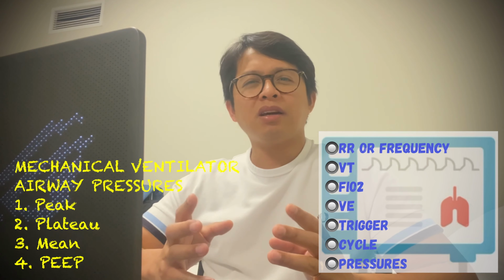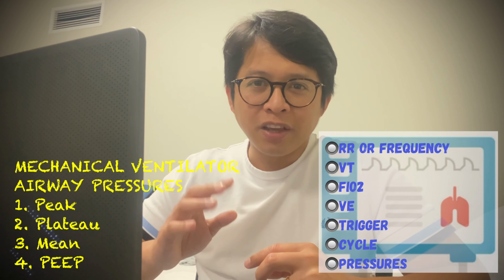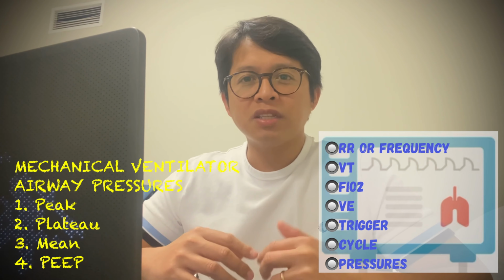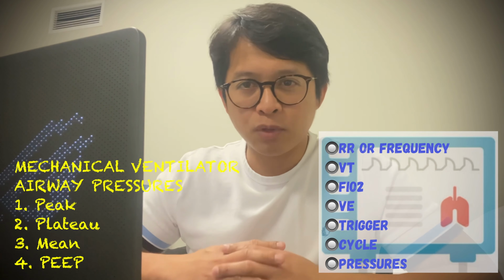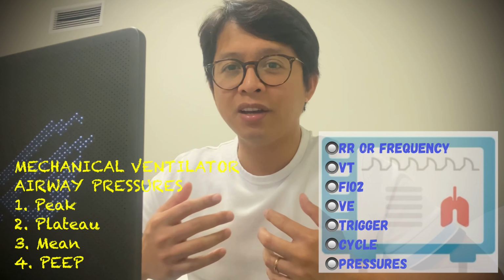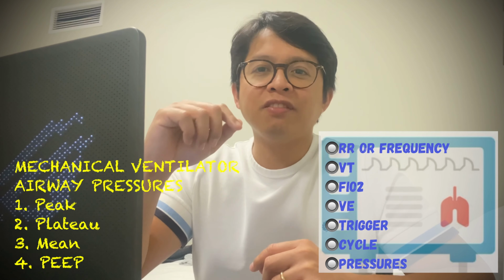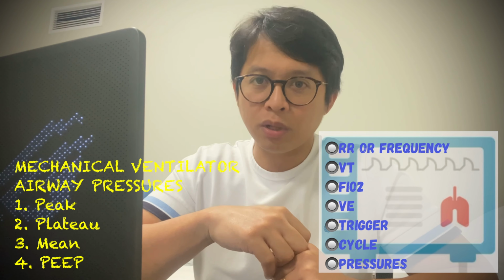There will be a residual there, okay? The minimal amount of leftover provides oxygen to the cells and prevents them from deflating and collapsing. So, the same on mechanical ventilation. We set the PEEP to prevent alveoli and lungs from collapsing.